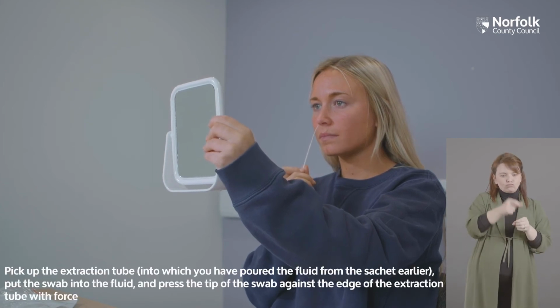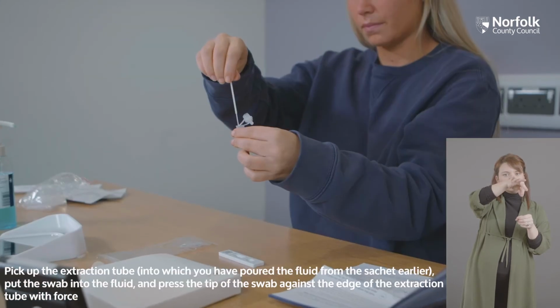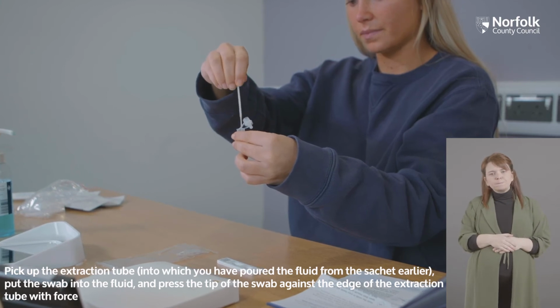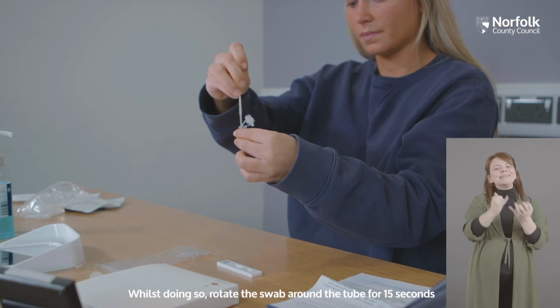Pick up the extraction tube into which you have poured the fluid from the sachet earlier. Put the swab into the fluid and press the tip of the swab against the edge of the extraction tube with force. Whilst doing so, rotate the swab around the tube for 15 seconds.